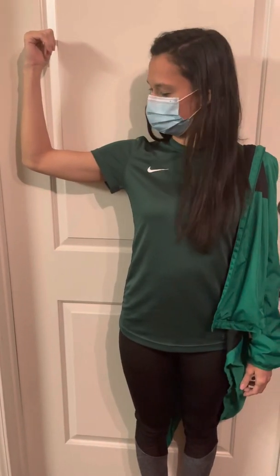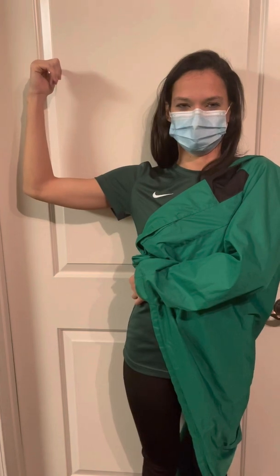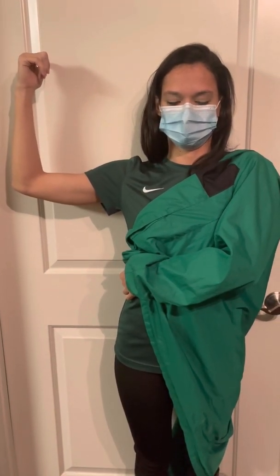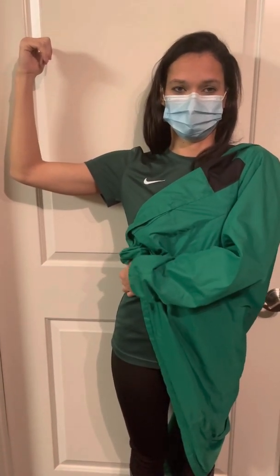For the humeral hitchhiker, use a 14 by 17 cassette. The central ray is at the mid-humerus. The patient has to be shielded. The patient flexes the elbow 90 degrees and abducts the shoulder to 90 degrees. The thumb is pointing posteriorly, palm facing head. The light is 2 inches past the AC joint, 2 inches above the shoulder, distal to the elbow. The central ray should go through the mid-humerus and the center of the cassette.